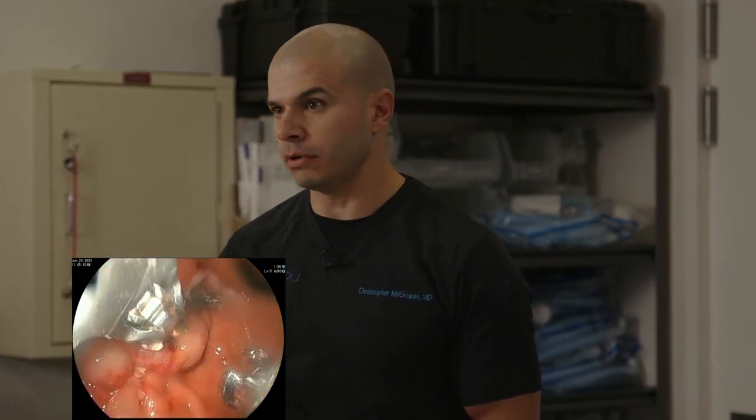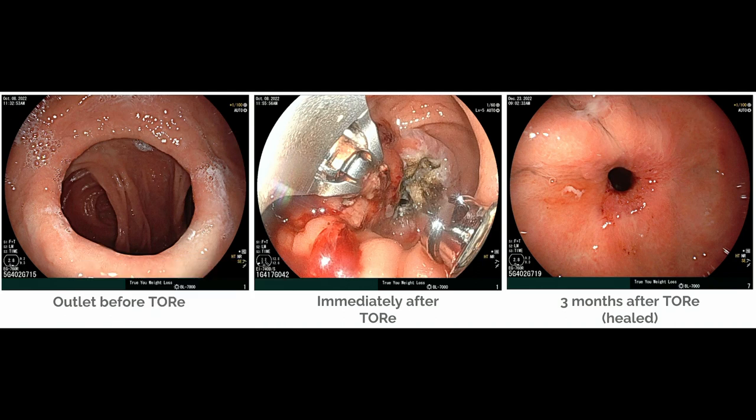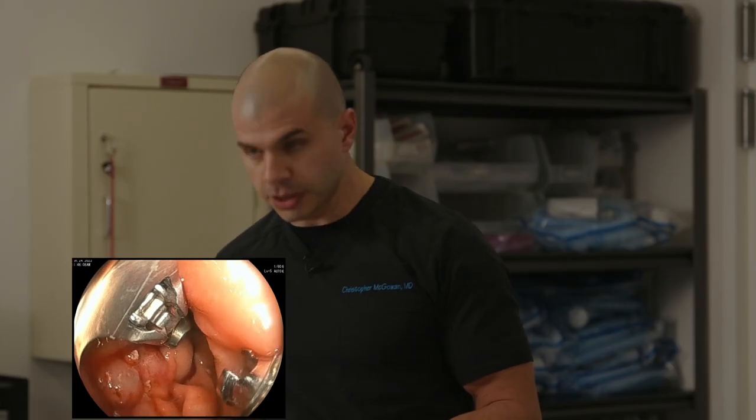Now, what's really cool is how this looks when it heals. We actually have an example, and we can go ahead and project that on the screen of a patient who had this procedure. So on the left panel, you can see what the outlet looked like before the procedure. Immediately after, looks remarkably like this one. And then the third panel shows 3 months later, and you can see complete healing. This looks like a fresh, completely healed, beautiful outlet, but much, much smaller. And so we can take that image down. But that's what this heals like.